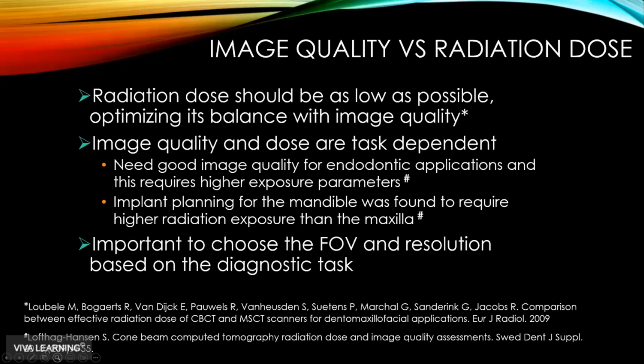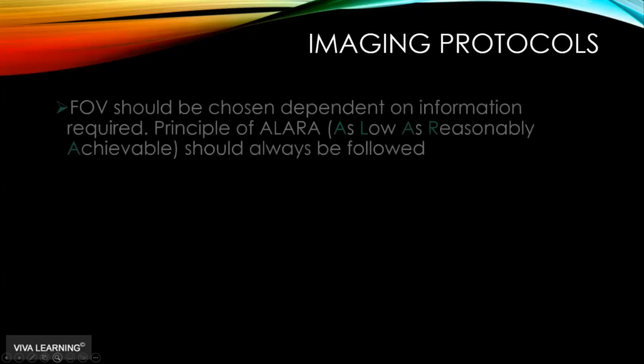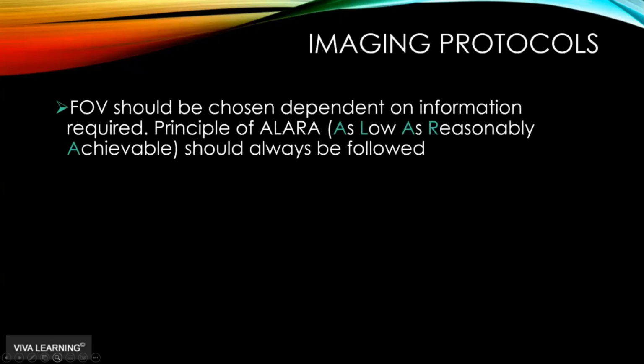There's no point in saying, well, I only exposed my patient to 20 microsieverts if in fact you didn't get the information that you wanted, because in reality then you just wasted 20 microsieverts, right? So we have to make sure that we choose the field of view and the resolution based on the diagnostic task at hand. So imaging protocols say that the field of view should be chosen dependent on the information required. And you've probably all remembered this from dental school.